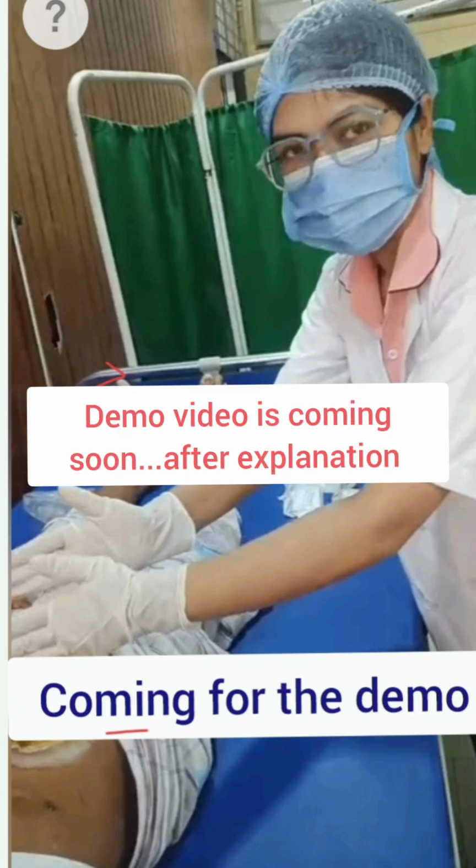Then afterwards I have inspected the stoma, where I have checked for color. It should be pink or red, the size, swelling, or any signs of irritation or infection. So in this client, the color of the stoma is pink and it is normal. There are no complications, the size is normal, the skin is intact, and there is no swelling or any signs of infection.